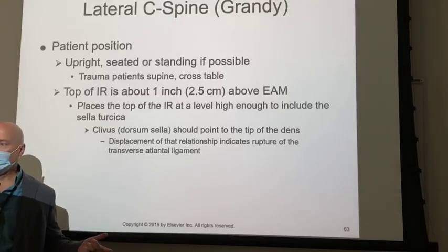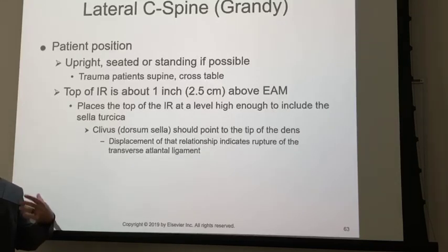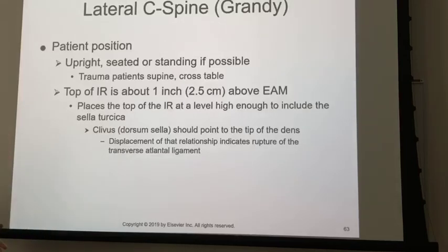I recommend that, if you work in a hospital where some hospitals will make these drapes that you can put on over the patient's head and pull. It's made out of a double layer or triple layer sheet. Then have one person pull. And the reason I say one person pull is because in a lot of cases you'll have two different people pulling at a different rate.